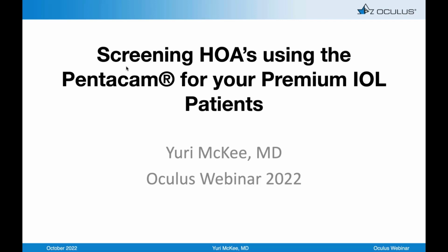And just as a reminder, myopic LASIK or PRK, you're going to see less than 80% usually. And then hyperopic refraction ablations, you're going to see above 85 usually. But when you get up into the 90s or 100s, then you're talking RK. So the interesting thing is RK was designed to treat myopia. Yeah, it's going to do the opposite of LASIK. So just keep those things in mind.